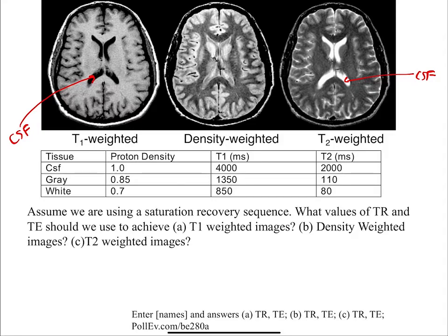Okay, let's talk about the white matter first. The white matter is the stuff that looks white here. Okay, so that's the white matter, and it also looks dark here. So that's the wiring of your brain. Those are all the fiber bundles going through your brain. All right, and then the gray matter is these areas here at the surface of the white matter. Here it's sort of hard to tell, but the gray matter shows fairly well here. Okay, so that's the gray matter. Those are your neurons that actually do most of the computation. All right.